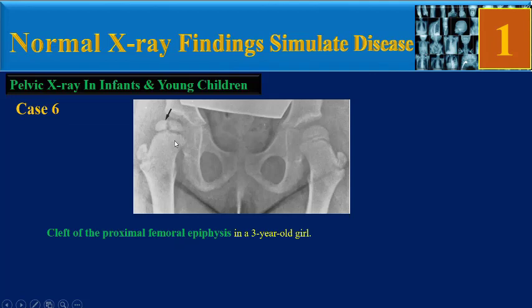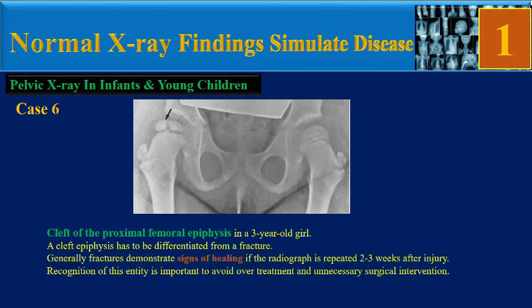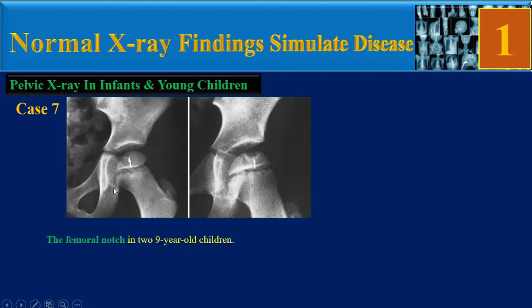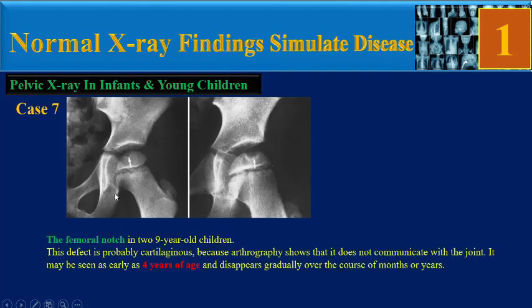Case 6: cleft of the proximal femoral epiphysis has to be differentiated from a fracture. Generally, fractures demonstrate signs of healing like callus formation if the radiograph is repeated two to three weeks after injury. Recognition of this entity is important to avoid overtreatment and unnecessary surgical intervention.